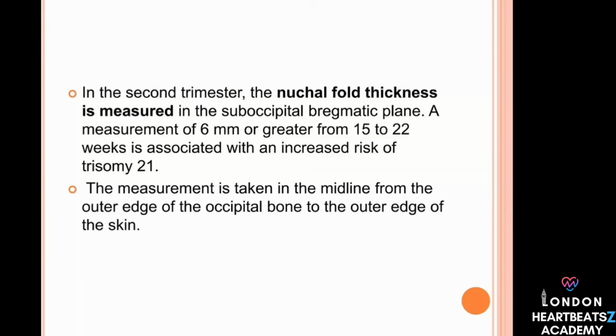Right, that completes a very thorough look at the head and face, covering brain development, potential anomalies, key measurements, facial features, and those important soft markers for genetic conditions. Let's move down the fetus now to the thorax, the chest area. What are the key components and features assessed here? Okay, when evaluating the fetal thorax, sonographers assess several basic but important features. They check the overall shape of the chest, noting that it should be regular and transition smoothly down into the abdomen. They also examine the ribs, ensuring they have normal curvature and checking for any deformities or fractures.